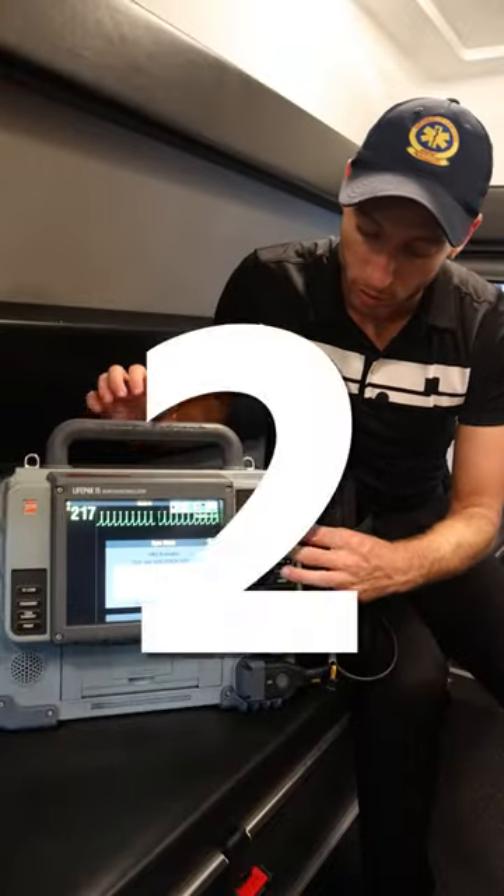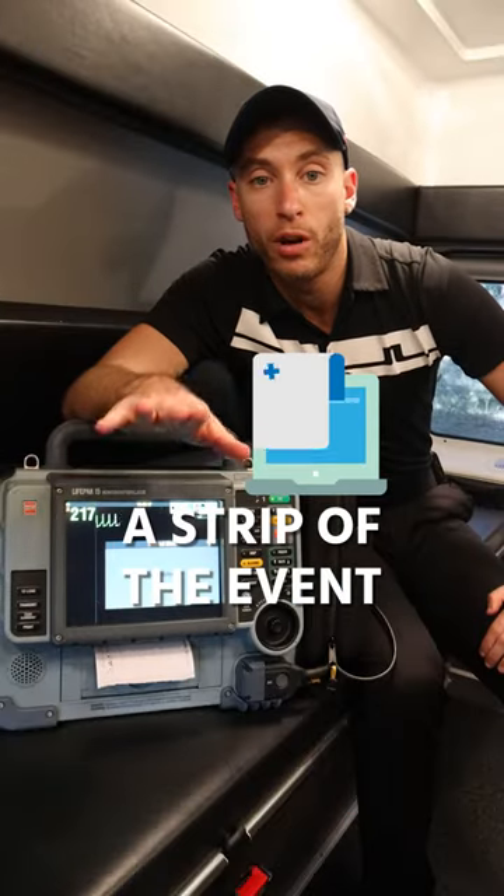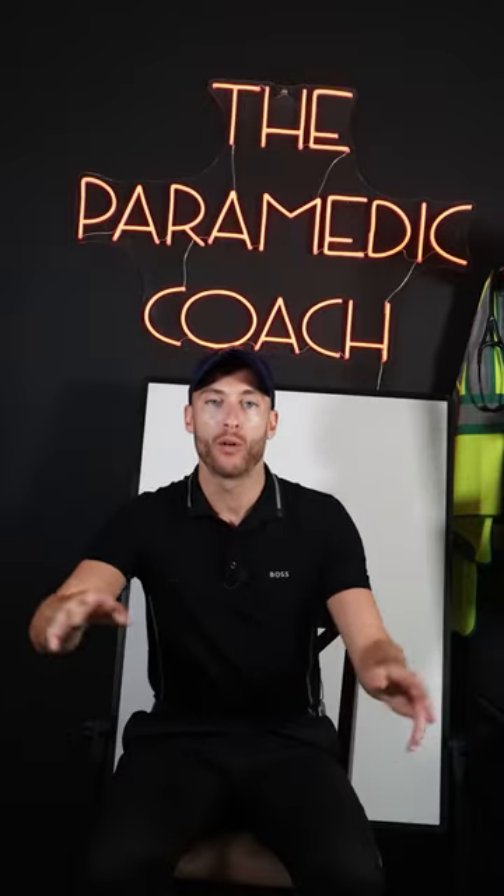Everybody clear — three, two, one — shocking. And now the heart monitor will print out a strip of the event. Follow my page where I go over all of it.